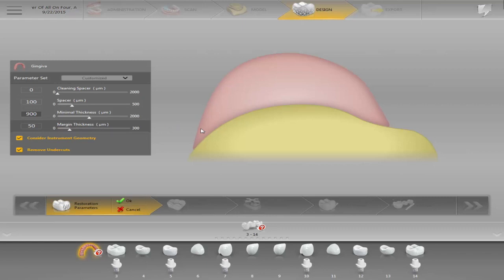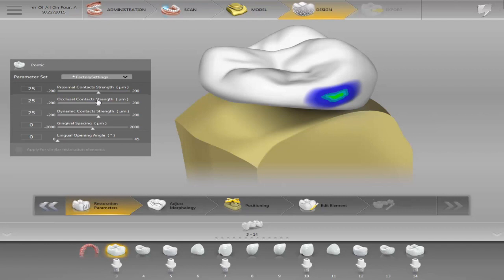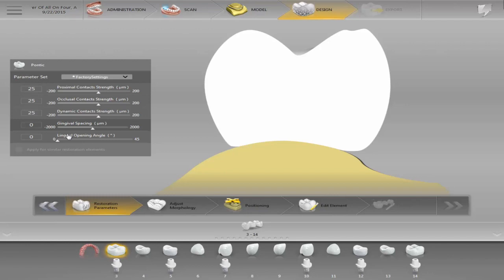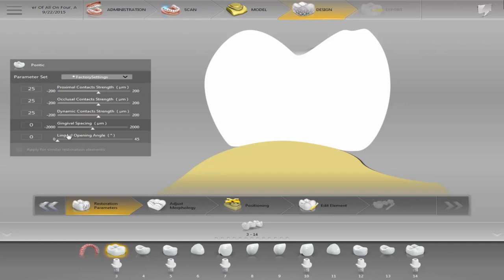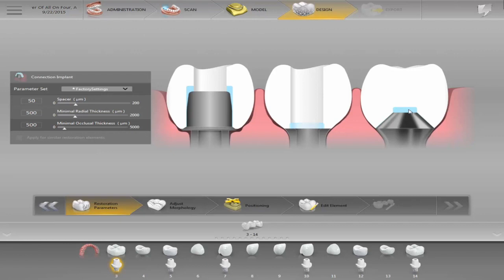For the crowns I also have set parameters. On the gingiva spacing at the bottom, I'm not really going to use that too much because I'm using gingiva on this case — they're all going to be exactly the same parameters. This will set your parameters around those multi-units, so you can move those around as well when it comes to minimal thicknesses and the spacer you're going to be using.